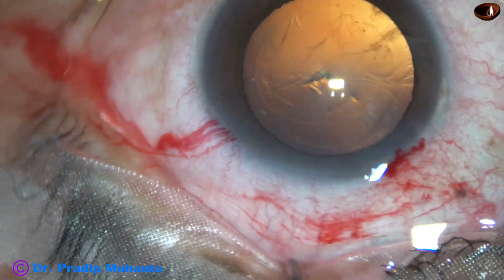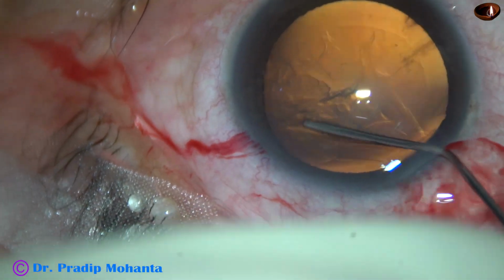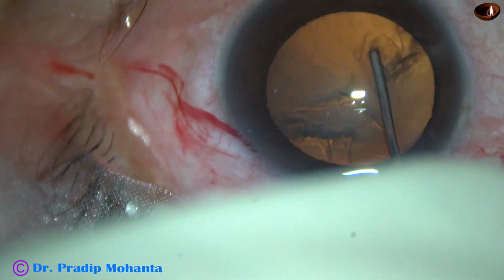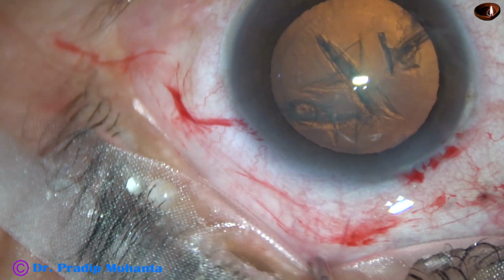And now hydrodissection is done. A 27 gauge cannula and BSS is used to do hydrodissection. The fluid wave goes to the opposite equator. Hydrodelineation was attempted, but no golden ring was seen in this case.